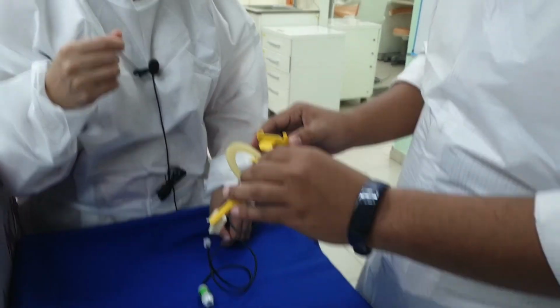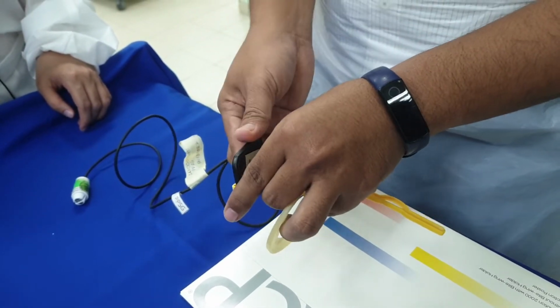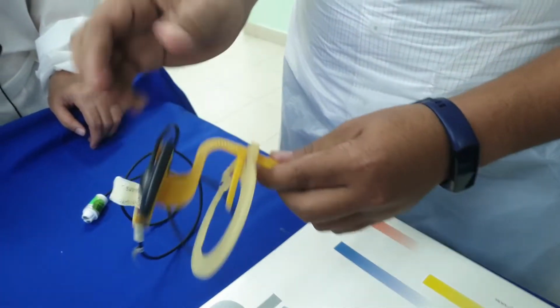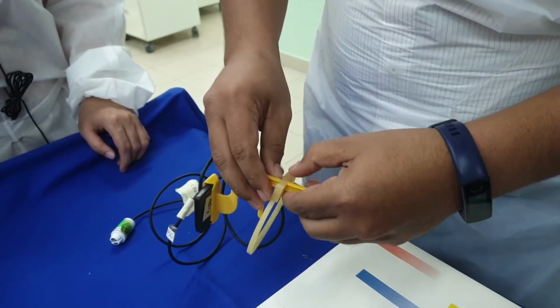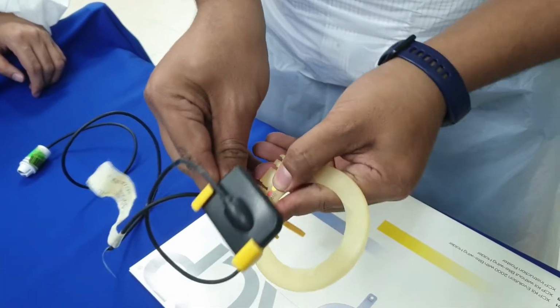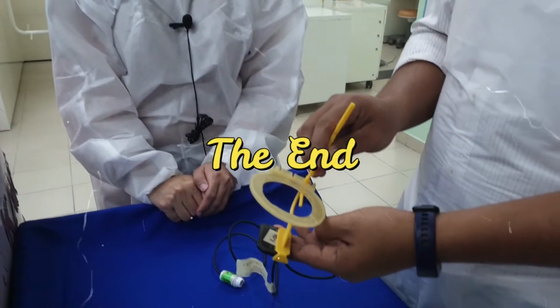Okay, to take X-ray of the upper right, you need to change the orientation. First, change the digital sensor. And then change the orientation of the locator ring. Right, now we can take the upper right posterior tooth and lower left posterior tooth.